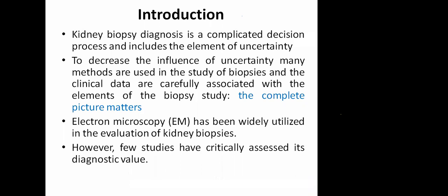Now, with the diagnosis of diabetes, the only thing is diabetic nephropathy. The only problem is that if the patient has nephrotic syndrome, then that thickening of the membrane can't explain such significant proteinuria. Early diabetic nephropathy can't explain it. So electron microscopy will be useful, because first of all, we will be able to assess the thickness of the GBM, the glomerular basement membrane, and in addition, since this patient has nephrotic syndrome, we would like to have a look at the foot processes also.